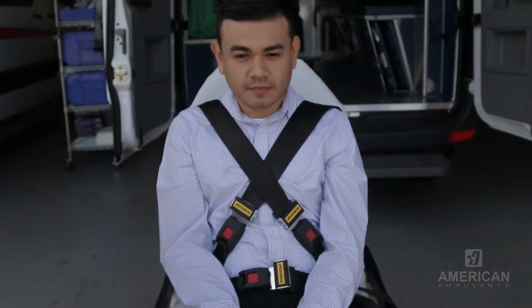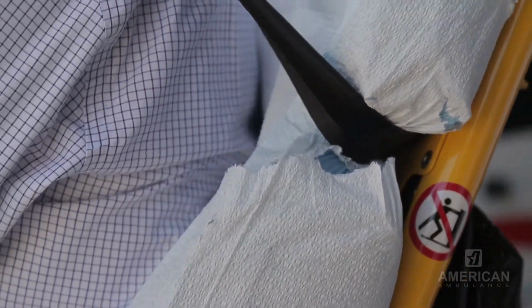In addition to that, the mattress has notches for the shoulder straps to move into. So as you place that patient onto the gurney, you may get a tear on the paper sheet, and that's okay. All right, I'm going to talk about loading and unloading the gurney with the power load system.